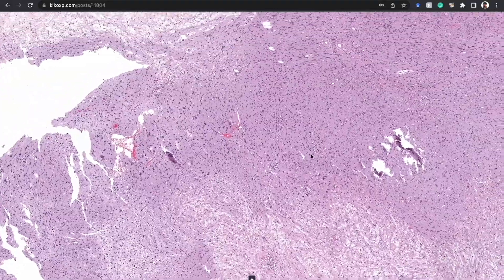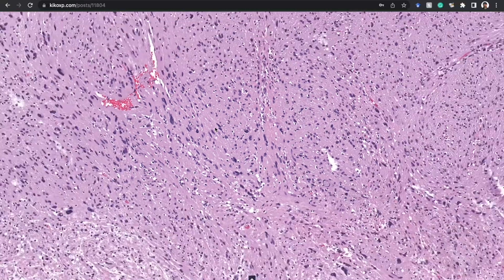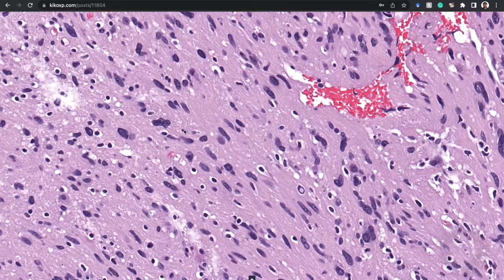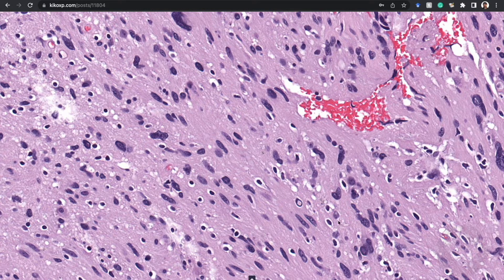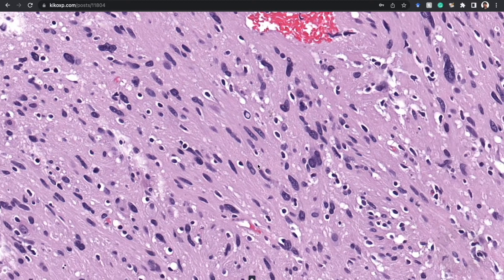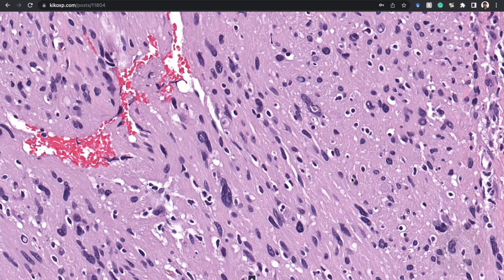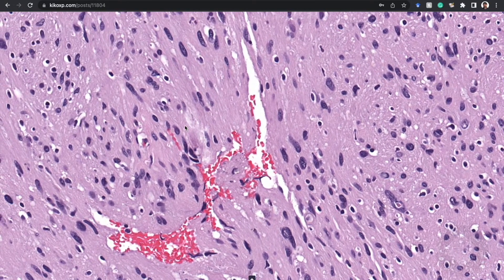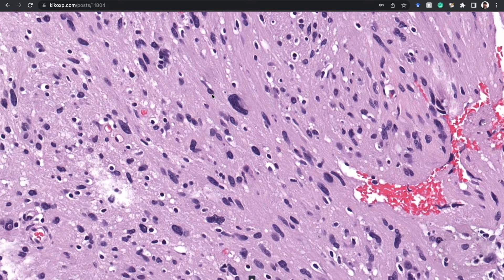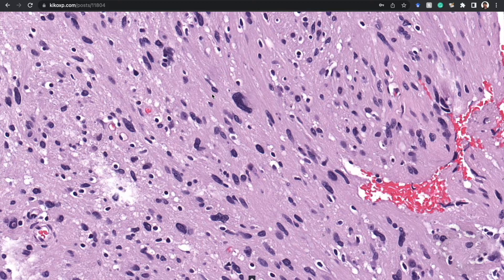In this case we don't have good Verocay bodies, but we do have some vague nuclear palisading. A lot of my trainees are skeptical when I point it out — they think I'm hallucinating, which is possible after drinking the Kool-Aid for so long. I actually learn a lot from what my trainees don't catch: either I'm wrong, it only works for my mind, or it's a subtlety I need to make more clear when teaching.